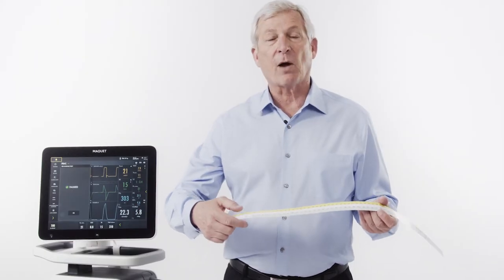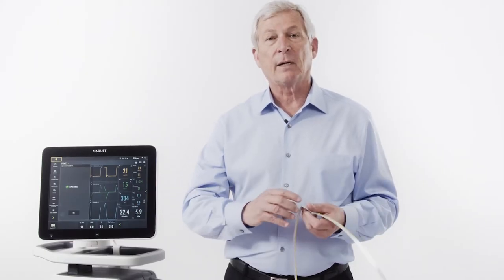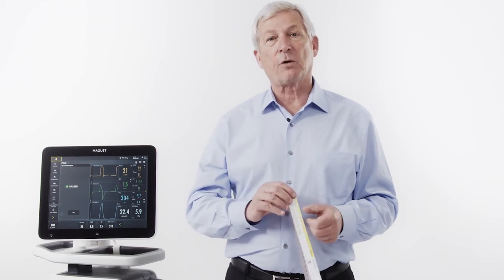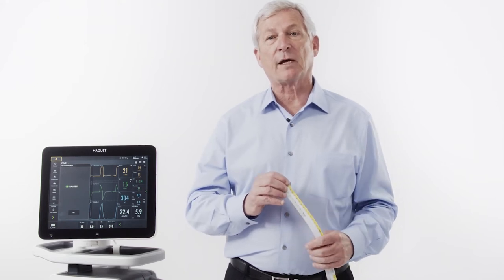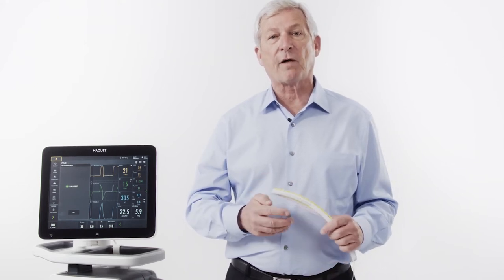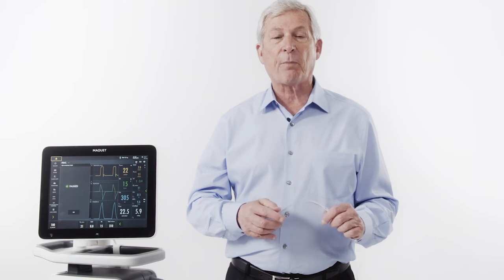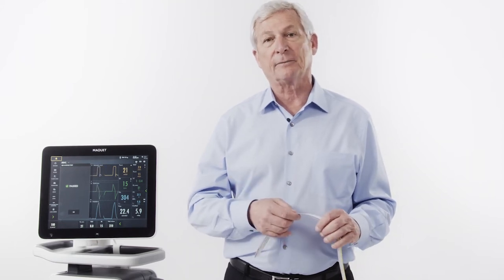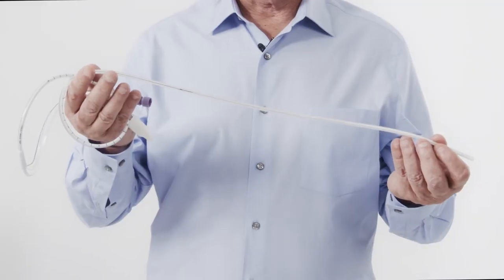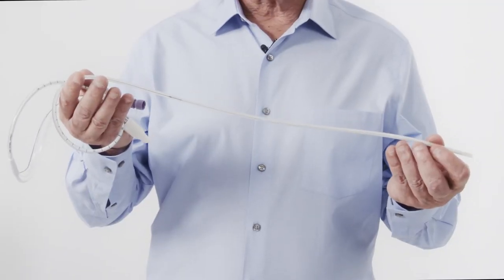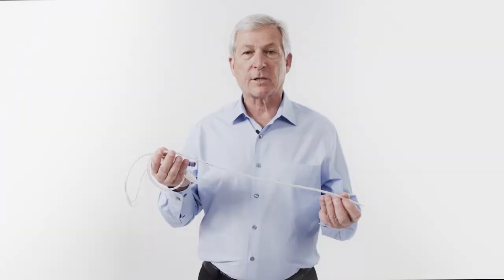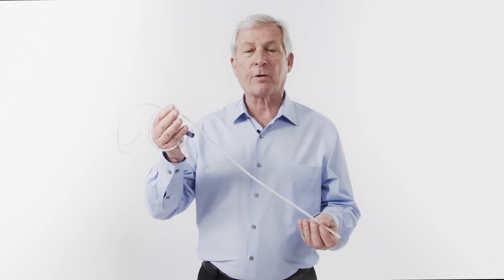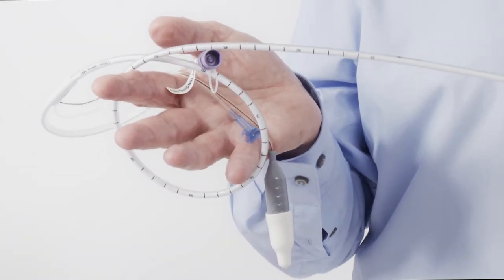If we use a regular tape, the servo ventilator will help you determine the proper insertion distance of the EDI catheter. The EDI catheter shown here is a 16 French catheter. It comes pre-lubricated — simply dip the tip of the catheter in water to activate the pre-lubrication.